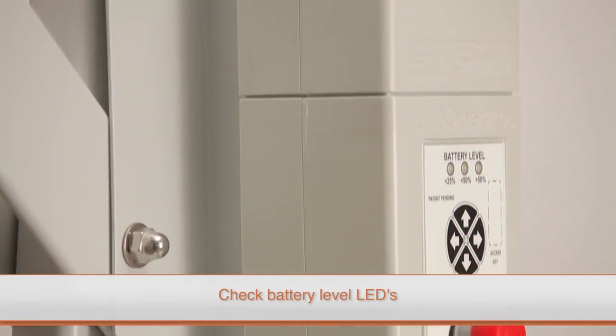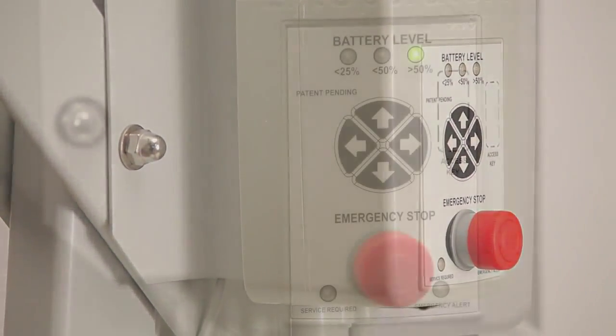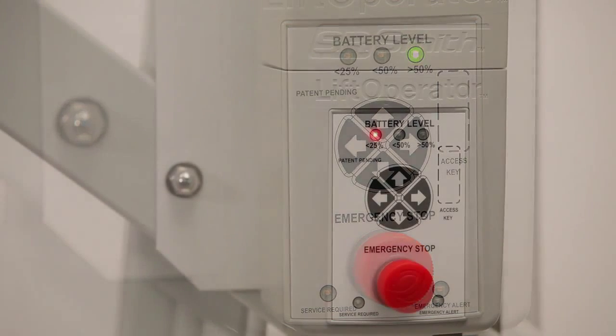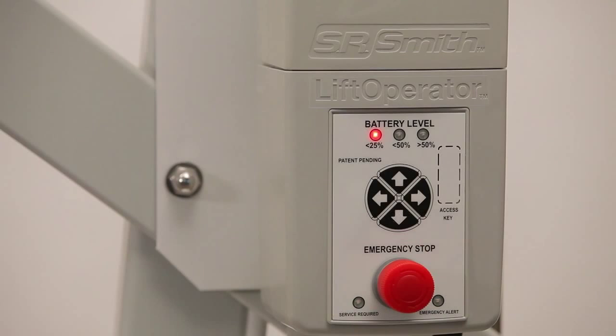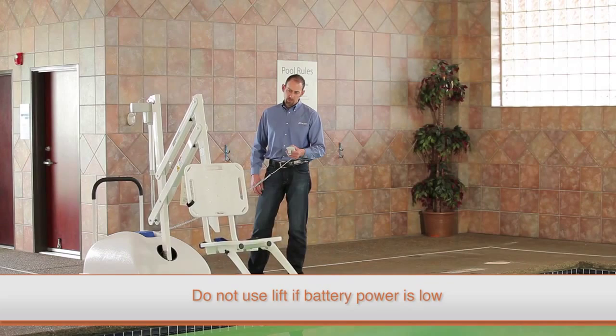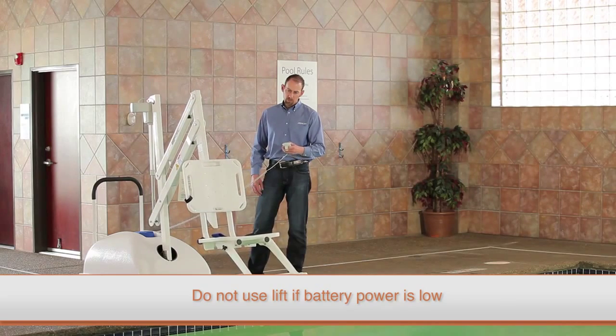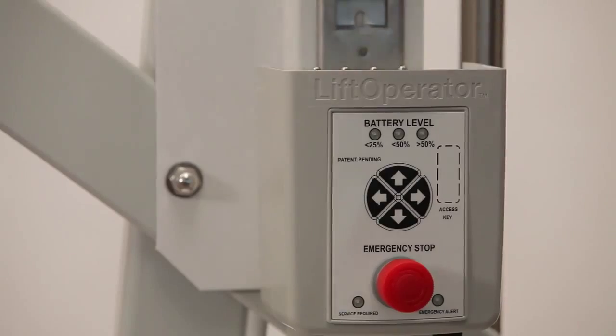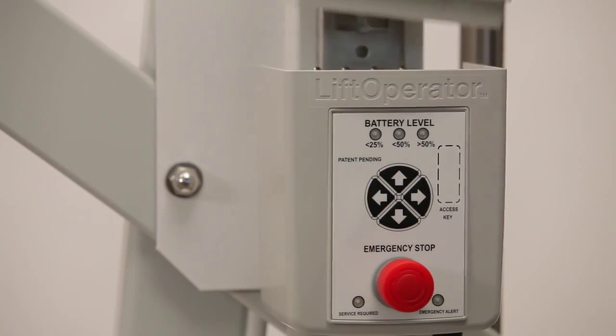Next, check the battery level LEDs on the front of the control box. A fully charged battery pack will illuminate green and above 50% on the LED. If the battery is showing less than 25% and the red LED is lit, do not use the lift, as the battery may not have enough power for a full operation. Remove the lift from service until the battery is fully charged or the battery is replaced with a fully charged unit.